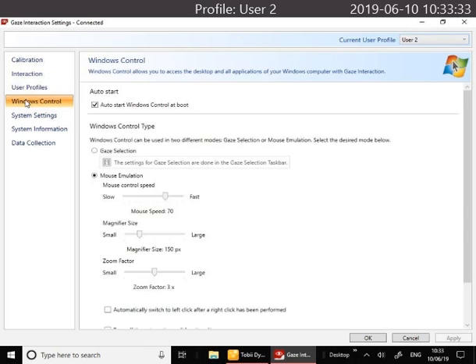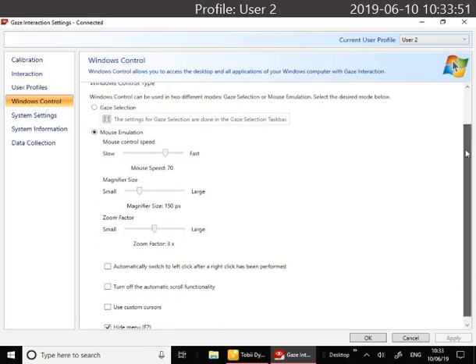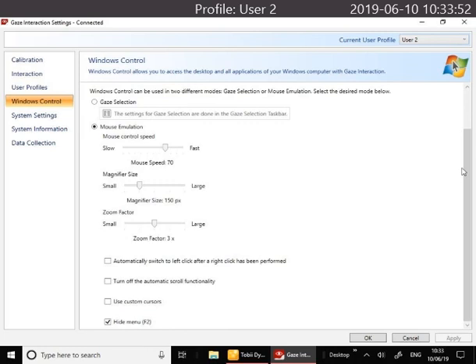But I'll just get into Windows Control. This is where you can tell the system to launch the eye gaze automatically when you turn on the computer. You might like to have that ticked if you're using Look to Learn, Sensory Eye Effects or other software. I'd suggest selecting Mouse Simulation because then you won't have a toolbar down the side.